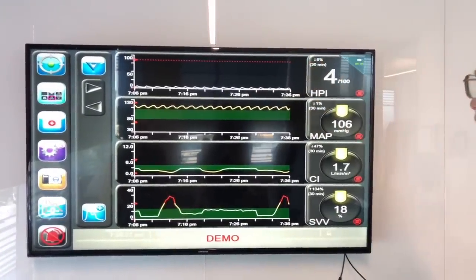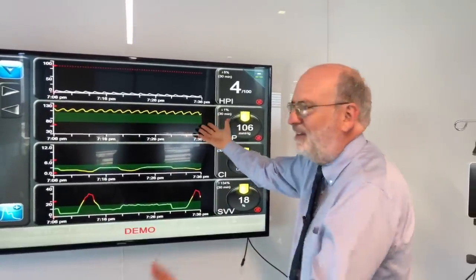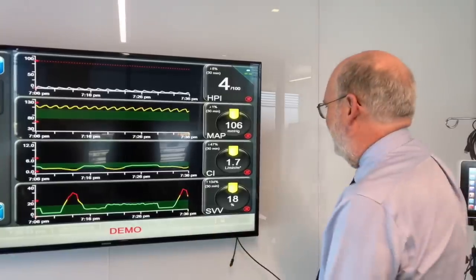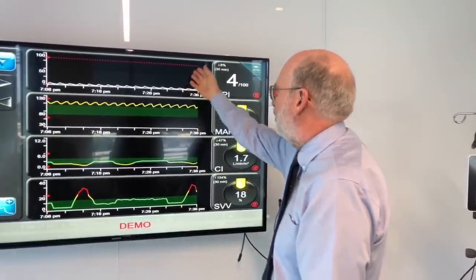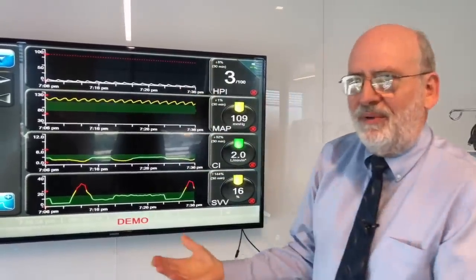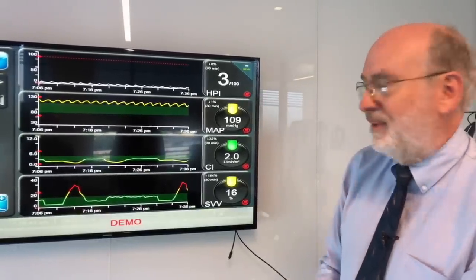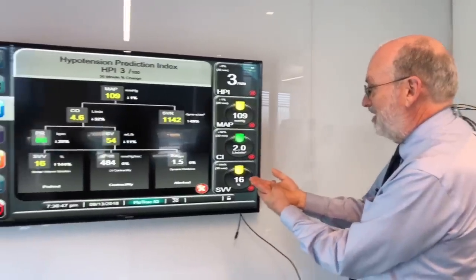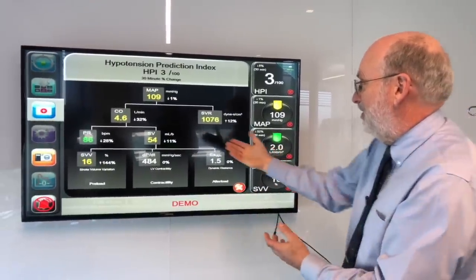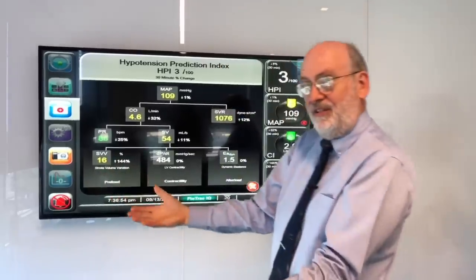And the crazy thing is, we started using this, and the mean arterial pressure kind of looks okay, and the index, this is kind of marginal, looks okay, and then this will slowly start to creep up. And then you scratch your head and try to figure out why it's going up and what to do, and then you look at this other screen that tells you where the output is going and the stroke volume variation, which is the CVP equivalent.